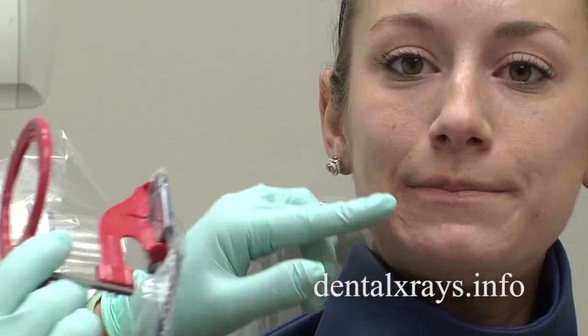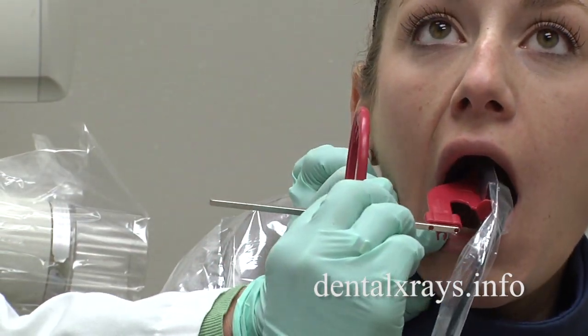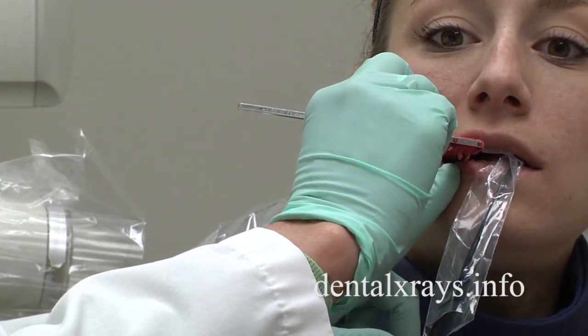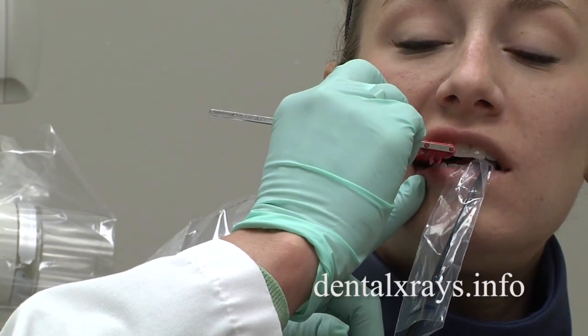However, when we're doing the premolar view, if I just move it toward the middle of the mouth and she bites down and I'm looking, I don't see the distal of the canine.